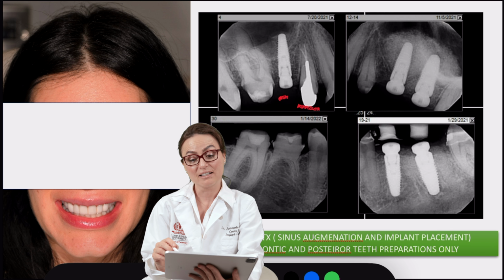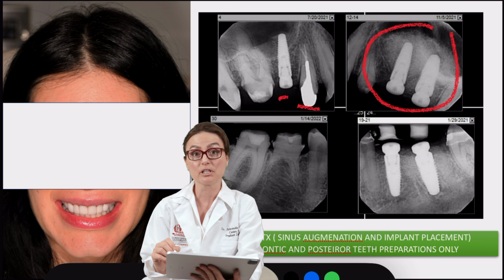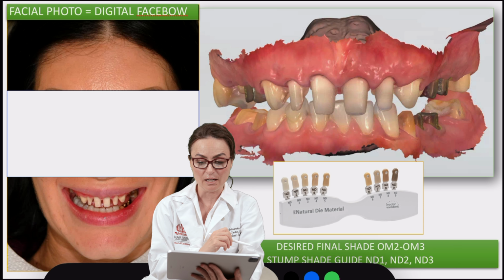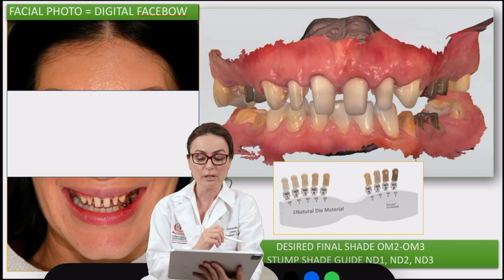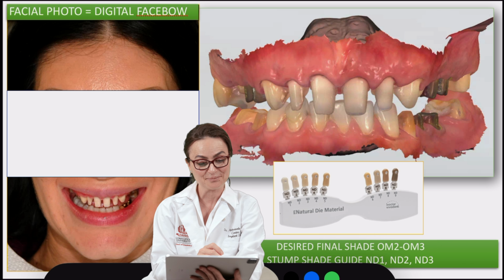On the upper left side, we decided to do a sinus graft, lateral window, and place 2 implants. On the lower left side, we lost the molar and the premolar to vertical fracture and severe decay, and we placed 2 additional implants. Okay, this is the plan to restore a very good, strong, stable bite in the posterior area. And then the patient really wanted to remove the present veneers, and we went ahead for the upper teeth, for the maxillary teeth, and considered new restorations that will make her smile even brighter and will even out with the new back teeth.